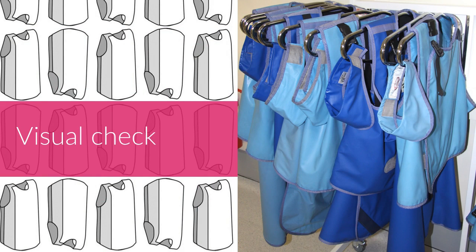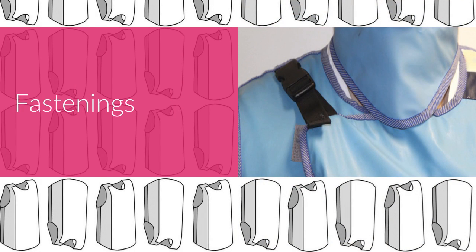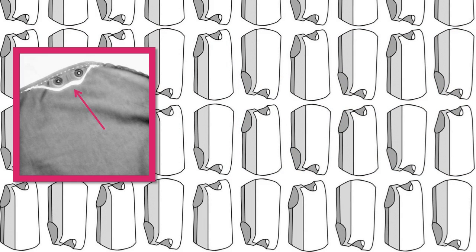Before you put on a piece of PPE, check it for signs of damage. Check the fastings first, as they are usually the first to show signs of damage. Look for tears and rips in the outer layer of your PPE.